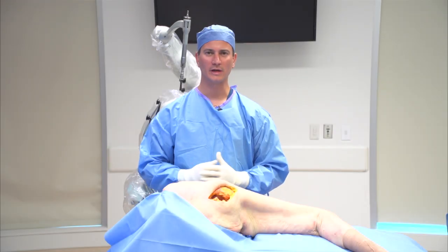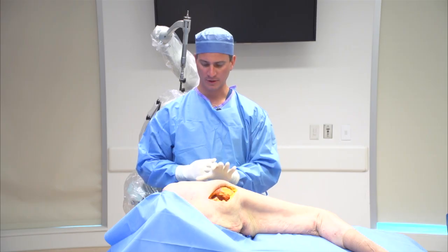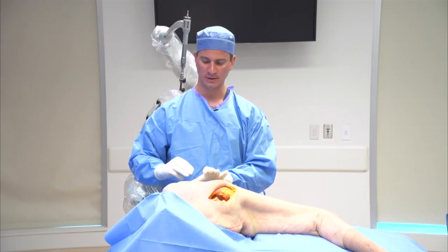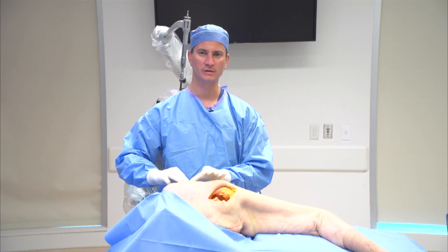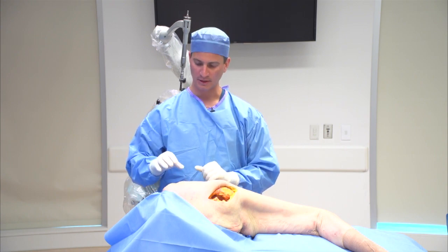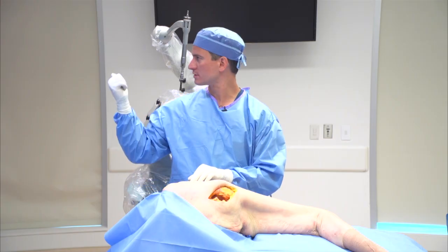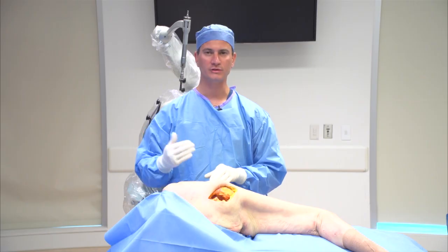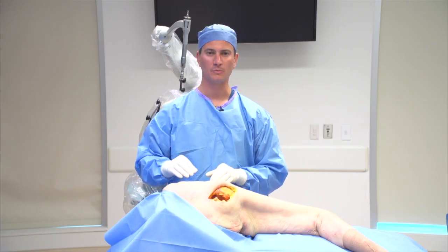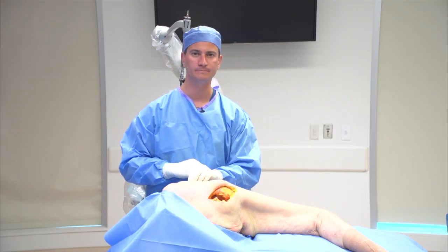So we've done a posterior lateral approach to the hip. The next step will be placing the pelvic array. So typically I palpate the ASIS, and approximately 3 finger breadths posteriorly is where I center the center pin, and then there are 2 flanking pins. And then you just have to be cognizant that you want that array facing towards the camera. I usually do this from the posterior position, so I'm going to walk around and do this as I would in surgery from the posterior side.